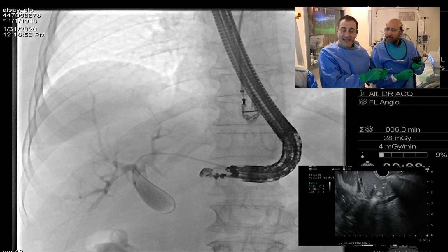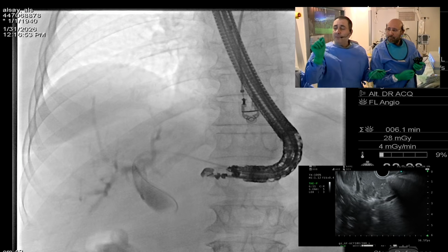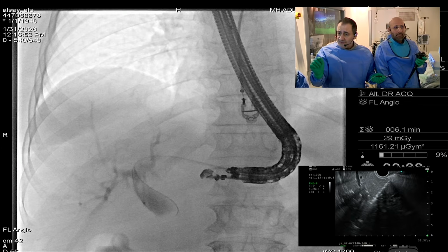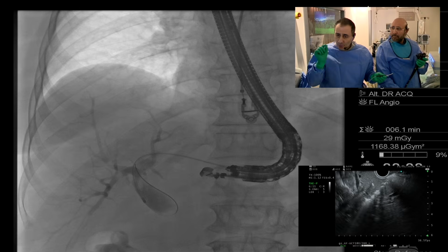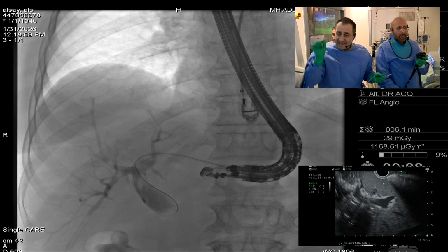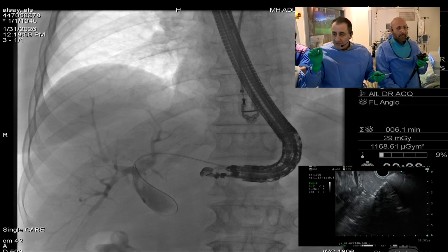You can. That means you're in. See, so that is the most important trick. I don't know if you guys pay attention. Once you're in the duct, you have to stop cauterizing and advance without cautery. That is the signal that you have reached the biliary tree.